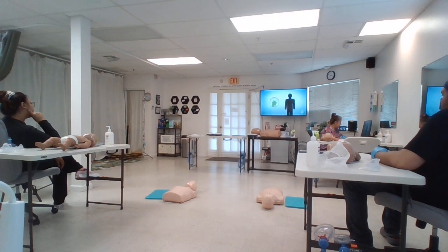The compressor assesses the victim and stays next to the victim's chest to perform chest compressions. When giving compressions, rescuers should switch compressors after every 5 cycles of CPR, about every 2 minutes, or sooner if tired. The rescuer positioned by the victim's head maintains an open airway and delivers breaths while watching for chest rise and avoiding excessive ventilation. The team member operating the AED or the monitor defibrillator can also serve as the CPR coach. The role of the CPR coach is to focus on team members' performance of high-quality CPR and to provide feedback as needed during the resuscitation attempt.